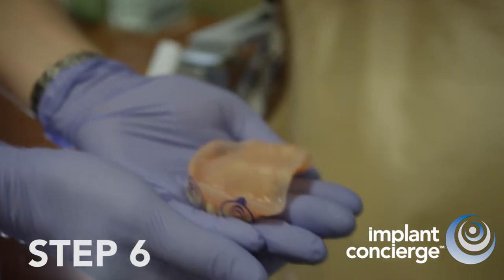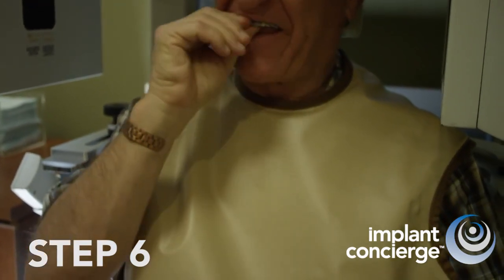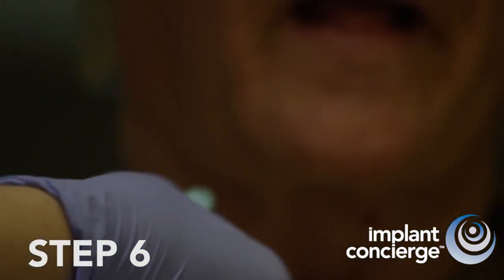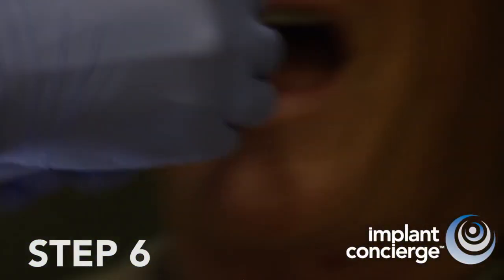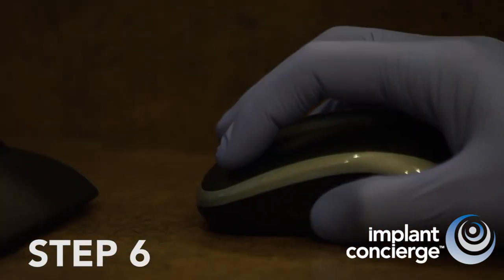Step 6. Take a Cone Beam CT scan of the patient wearing the denture with the x-ray markers. Do not move the x-ray markers. You can either scan both arches or just the arch of interest. A high-resolution scan is not desired. Use the bite registration to ensure that the denture is positioned accurately and stays in place during the Cone Beam CT scan. Place three cotton rolls in the vestibule to create space between the soft tissue and the denture. Be careful not to move the x-ray markers. Now, take the image.